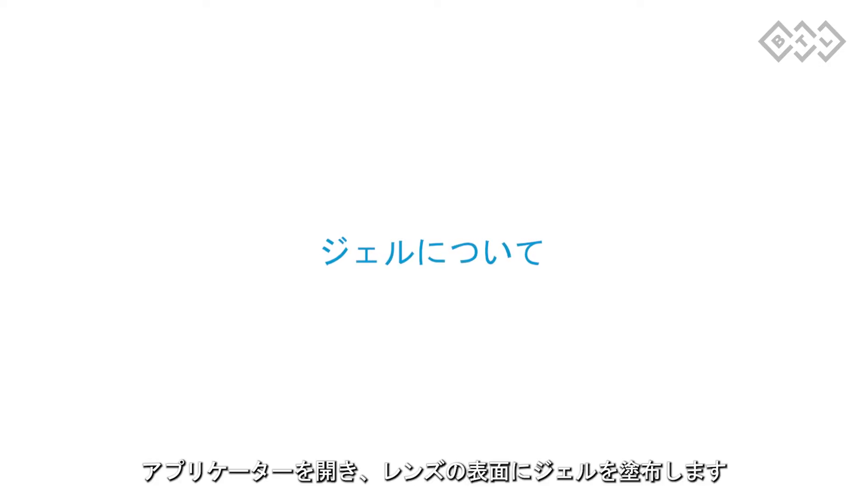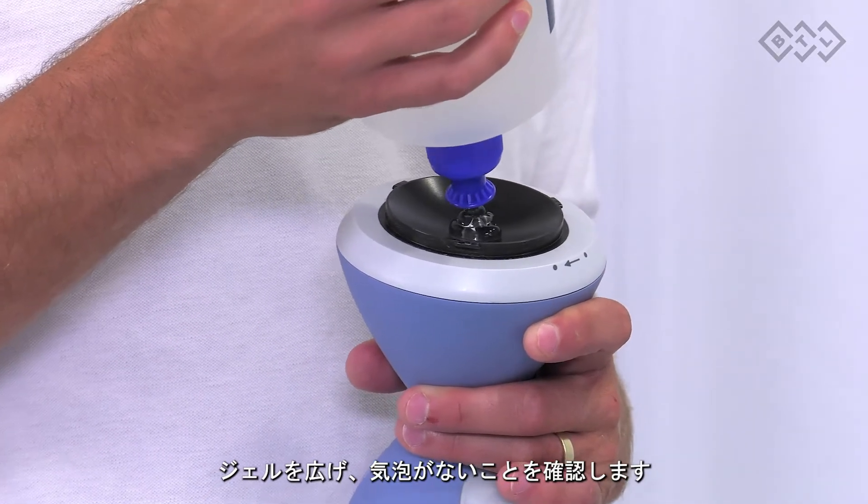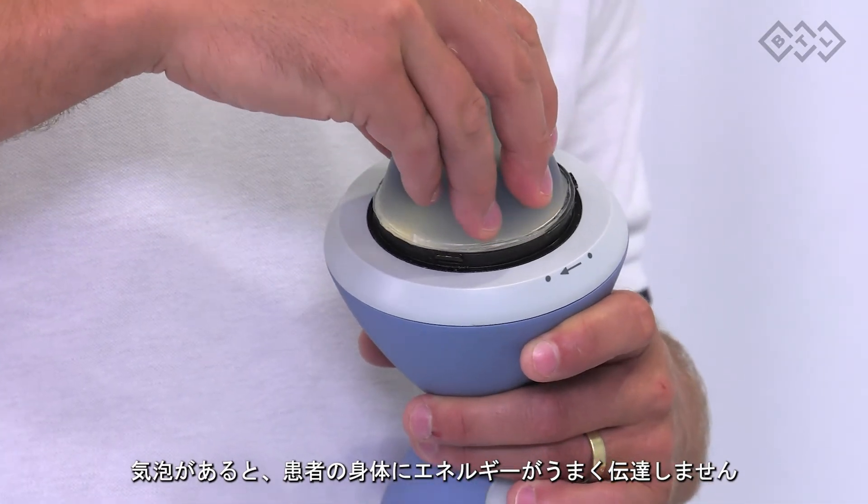Open the applicator and apply the gel on the lens surface. Spread the gel and make sure that there are no air bubbles. Otherwise, the energy transfer to the patient's body is less efficient.